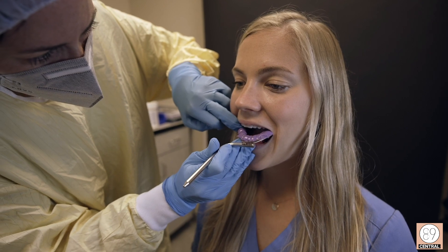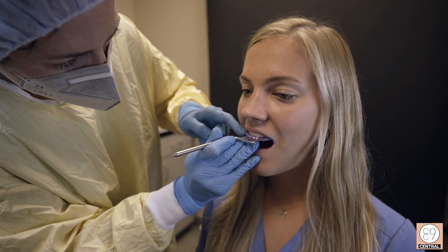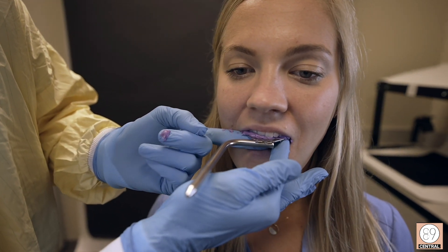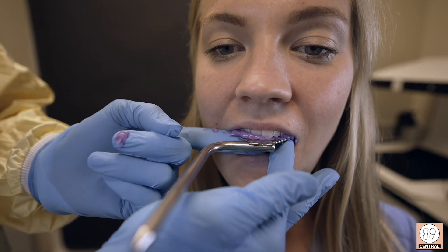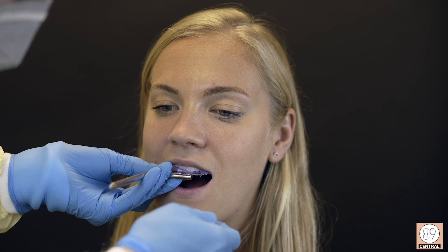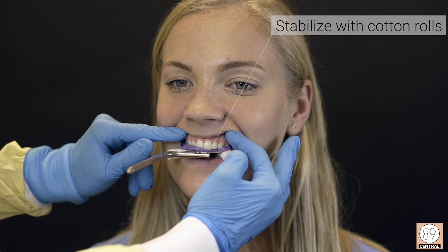Place your bite fork in the mouth and stabilize it with your hand. There is a notch in the front of the bite fork — be sure that it lines up with the midline. Once the material is set, you can stabilize it with cotton rolls. Just be sure that it isn't rocking.